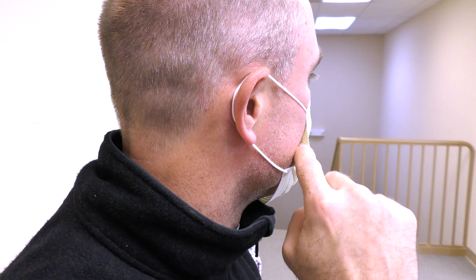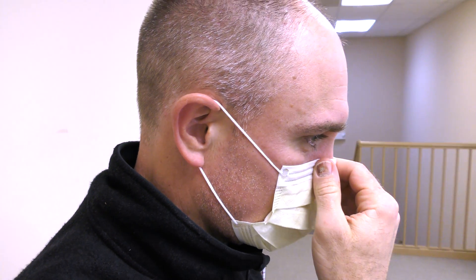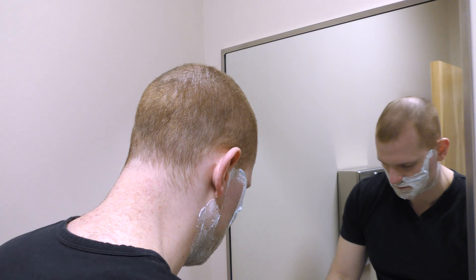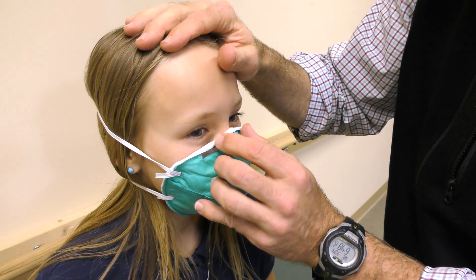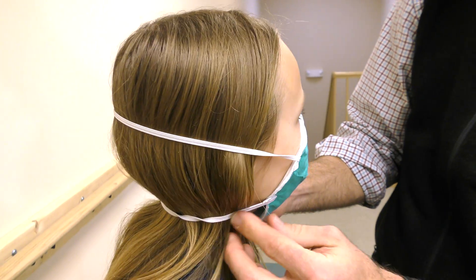However, an N95 mask works properly only when it is correctly fitted with an adequate seal to the face. Otherwise, it will work no better than a surgical mask. Facial hair should be removed as it may prevent a tight seal. Also, make sure it is the right size for your face — for example, an adult mask will not fit properly on a child.